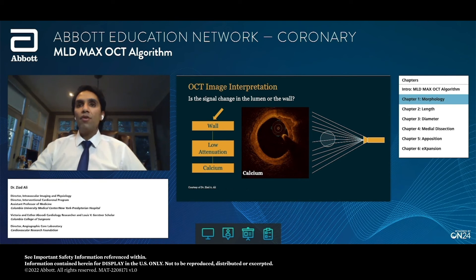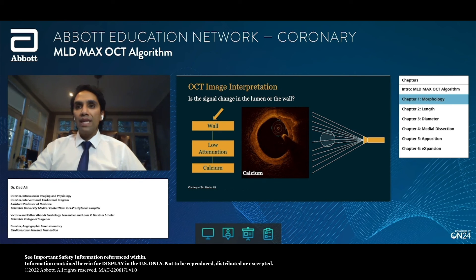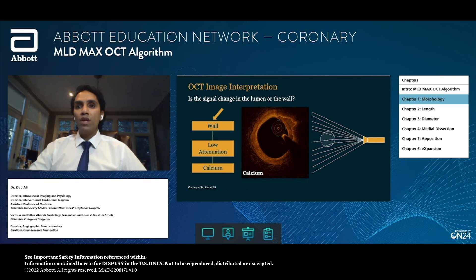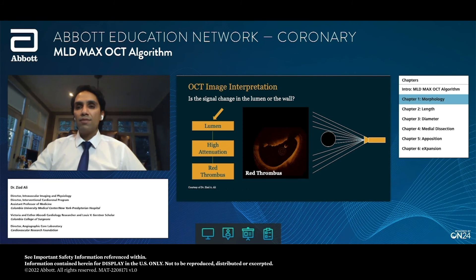Here we have another pathology within the wall — there's a signal change in the upper right quadrant of this cross-section. But in this instance, the light is hitting this object and then refracting, and you can still see behind this structure. We can also easily draw around this very well-demarcated structure. When you have a pathology or signal change in the wall and it's low attenuation, this is calcification.